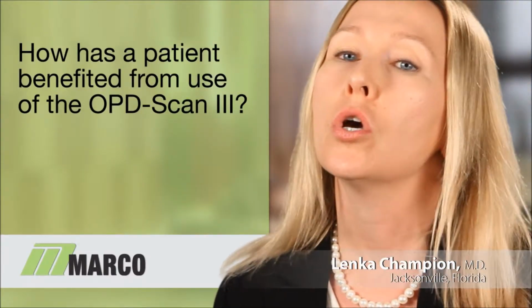Well, I think the OPD scan is a wonderful tool, especially for patients who have had multifocal implants. I have certainly, as any other surgeon, had a patient with an outcome that is less than ideal. I can think of specifically one patient who, after his surgery, with an uncorrected vision of 20/25 J1, nicely done surgery with a nicely centered implant, was still unhappy. So we went back and started looking at what could be the cause.